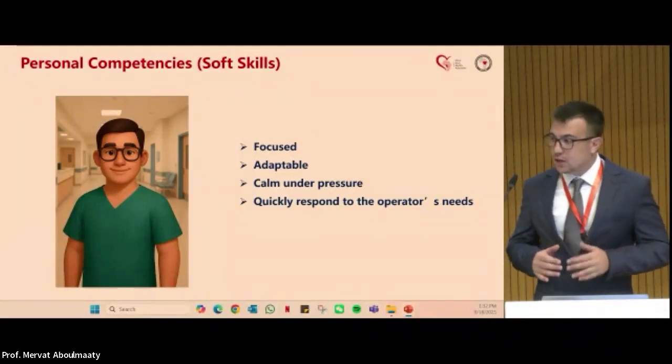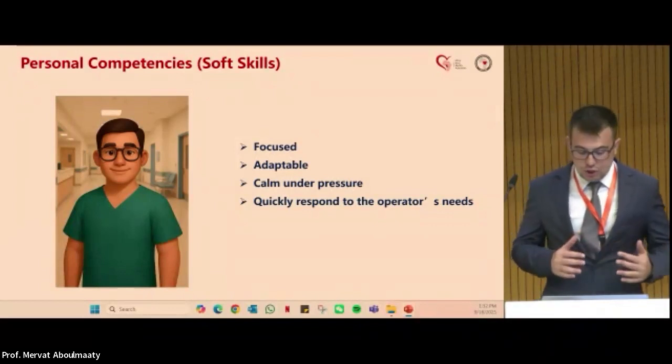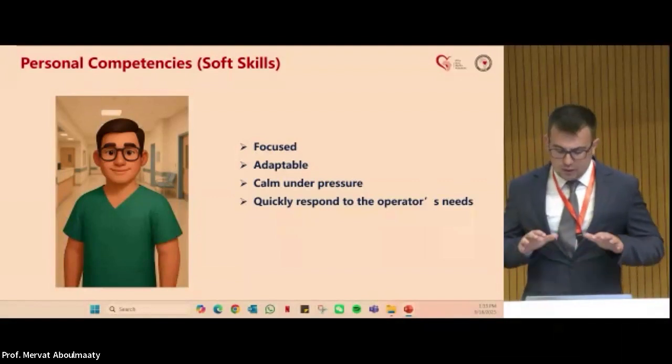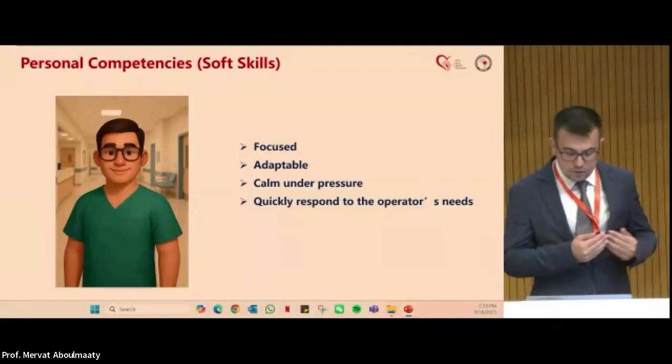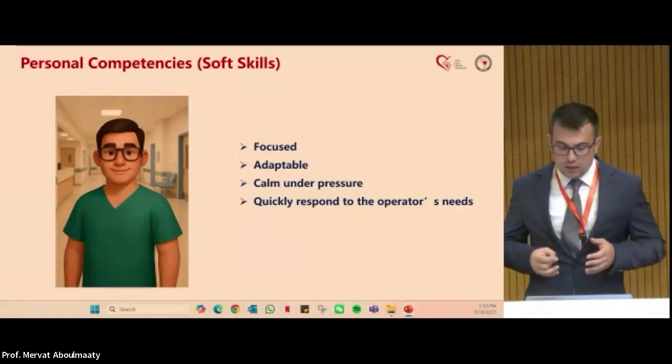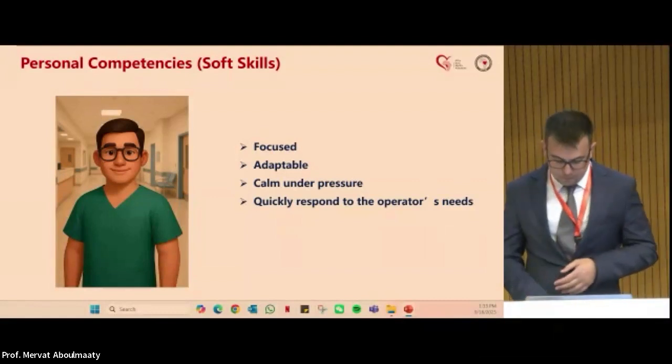During the case, sometimes the patient's hemodynamics can change and we can feel under pressure. At that time, we need to be calm and communicate with the physician, and whatever the physician needs from us, we can do as soon as possible.